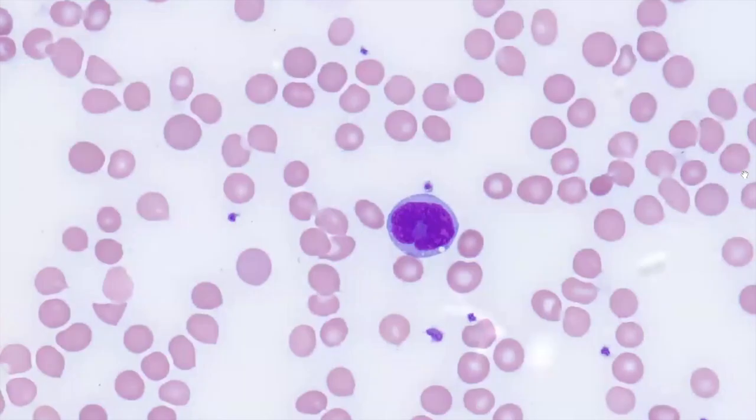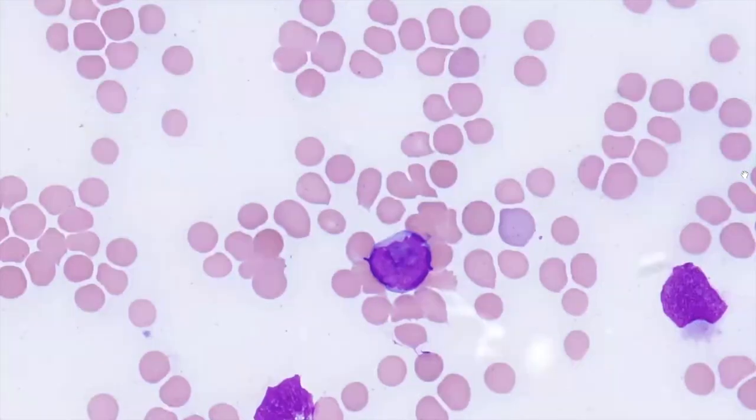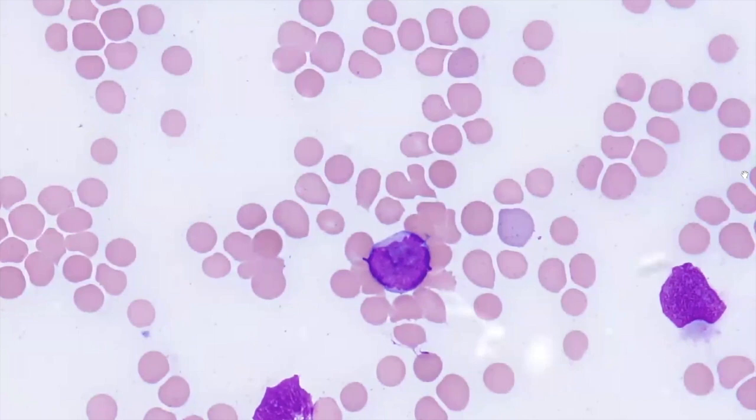Here we see an example of a blast with characteristic cup-shaped or fish mouth morphology. These buzzwords are used when pathologists know that there's a recurrent genetic abnormality, including NPM1 or FLT3. Of course, we wouldn't assume that this cell had that abnormality without doing the ancillary testing required to make those diagnoses. Here's another example of a cup-shaped blast or fish mouth blast, where you see a sort of indentation on one side of the nucleus.